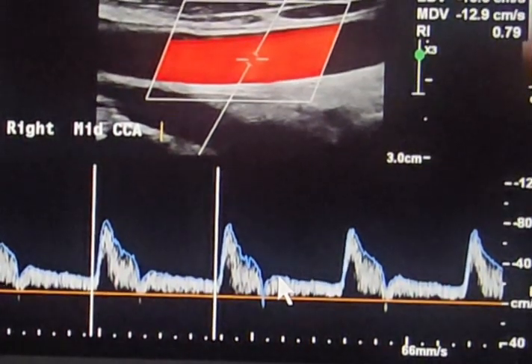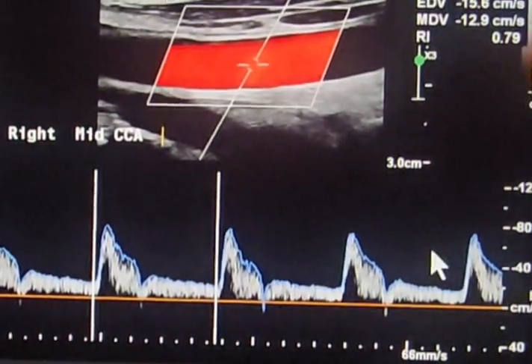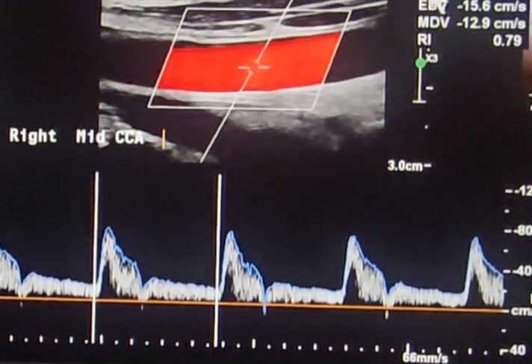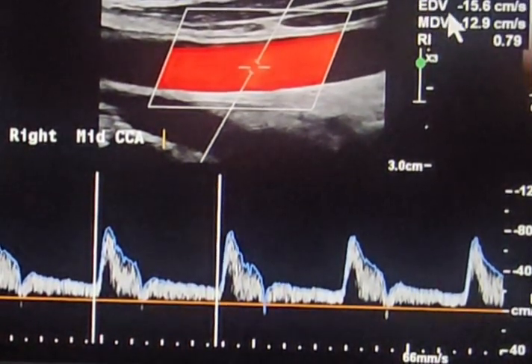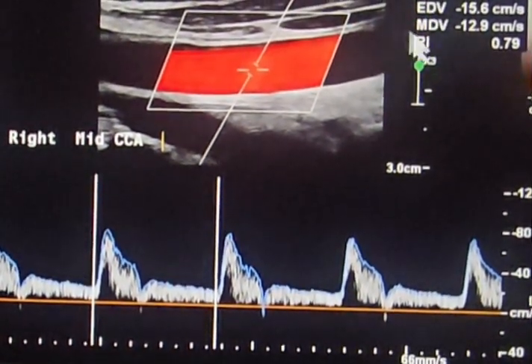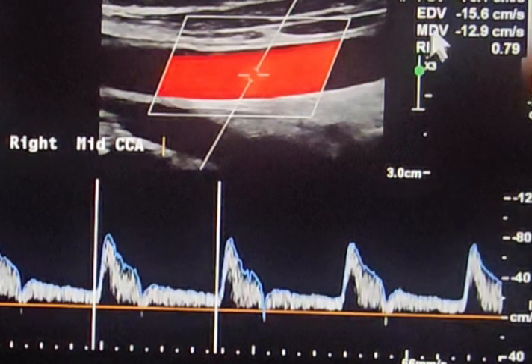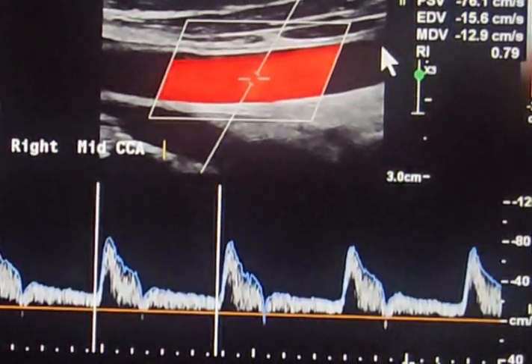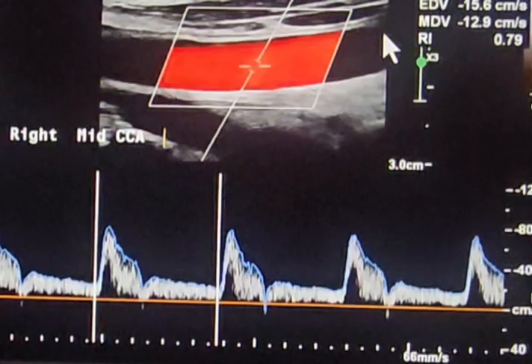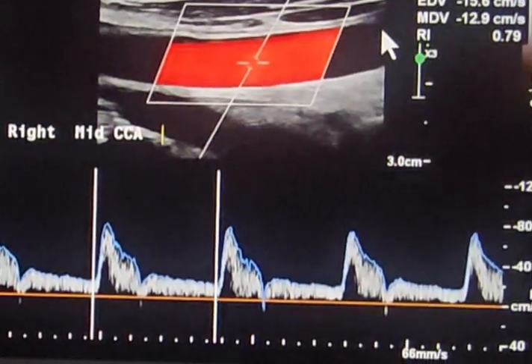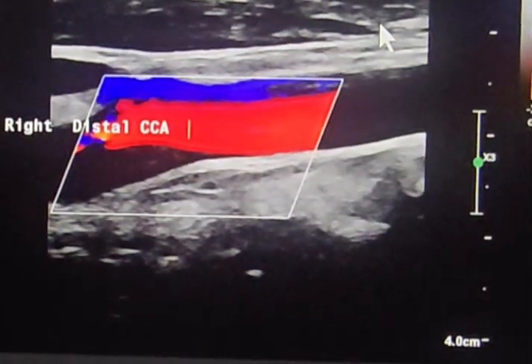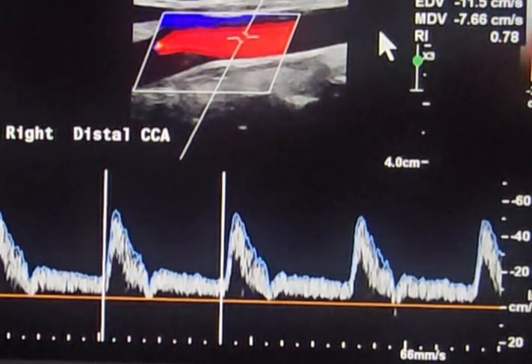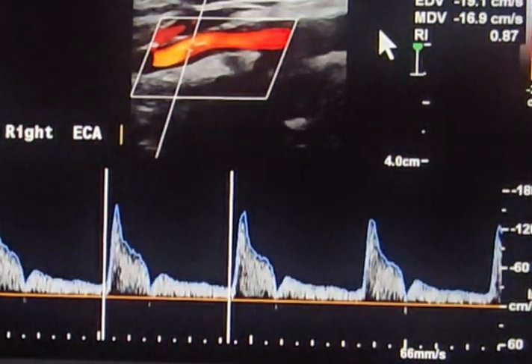These velocity measurements — peak systolic velocity and end diastolic velocity — are very important whenever we have stenosis at the internal carotid artery. Now we move distally and will document some velocities there as well.